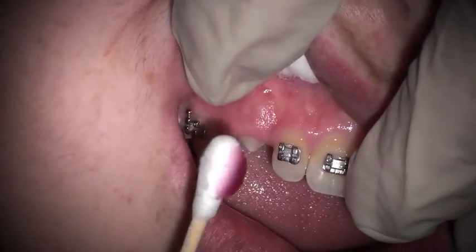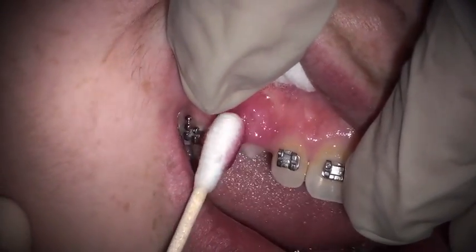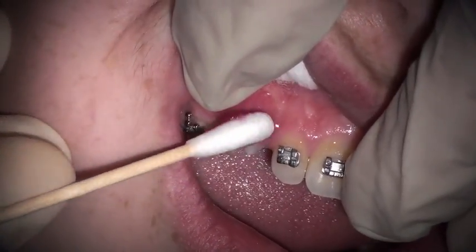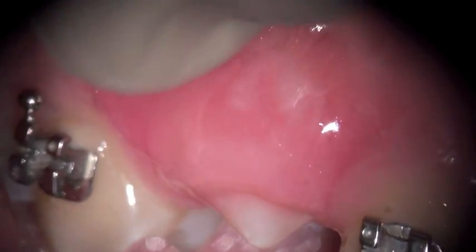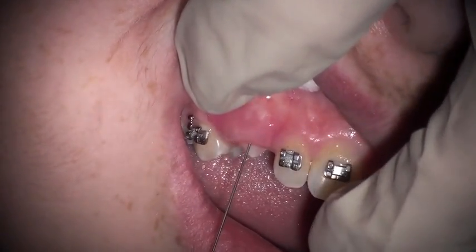And you just want to remove a little bit, so we'll just put this on. This sets after 30 to 60 seconds and then it will last 30 minutes or so. Put some on the surface there. So this is topical caine liquid — it can be dispensed. This is not a needle-dispensed.